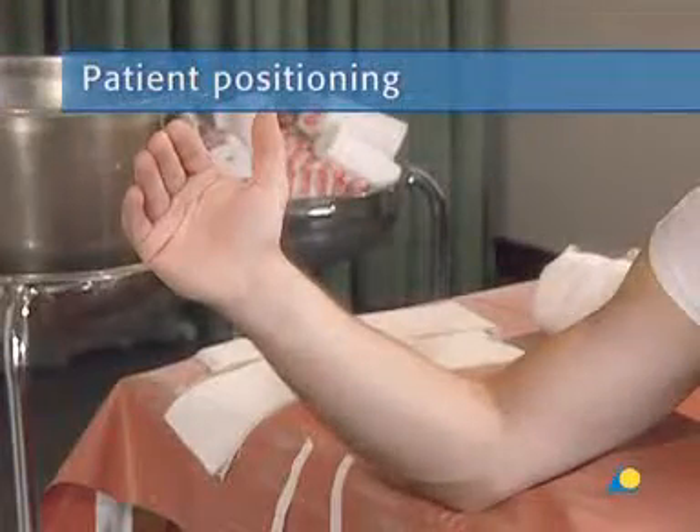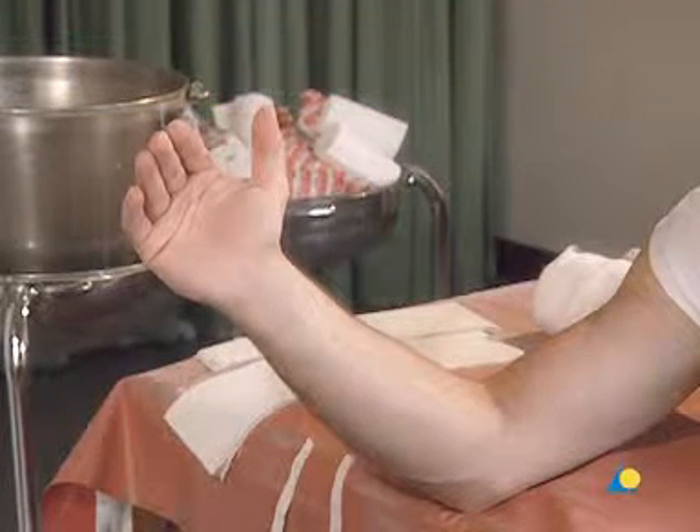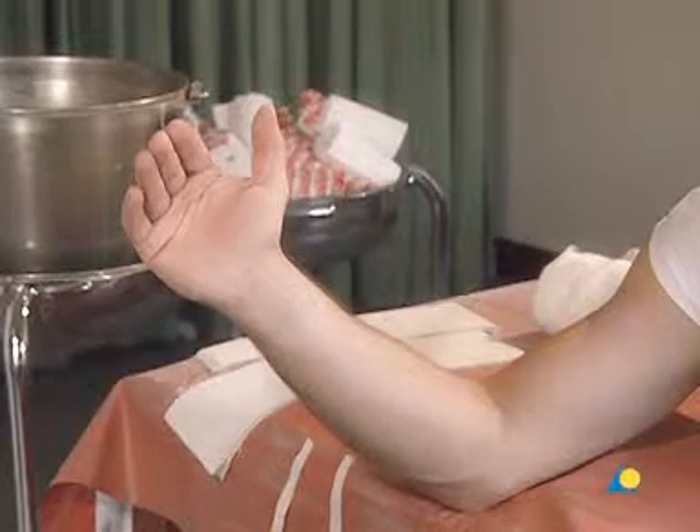The patient should be seated next to a table or trolley, with the elbow at the edge of the table, to allow full access to the forearm and wrist.